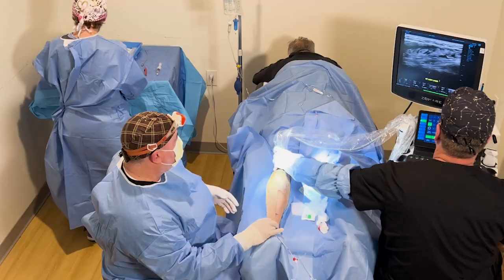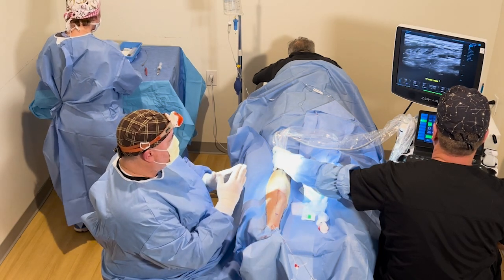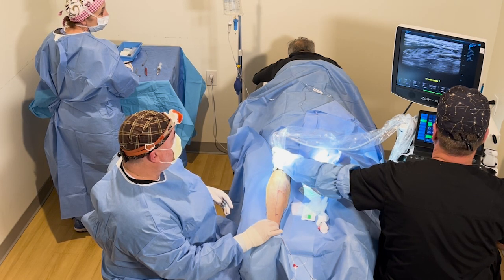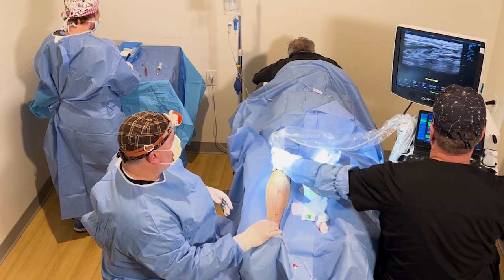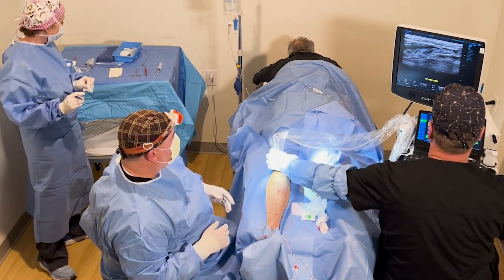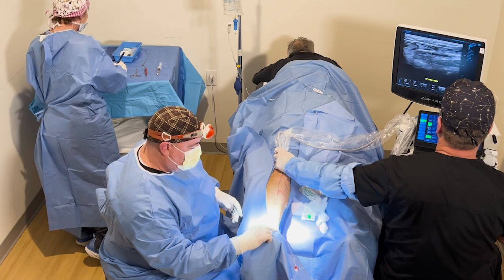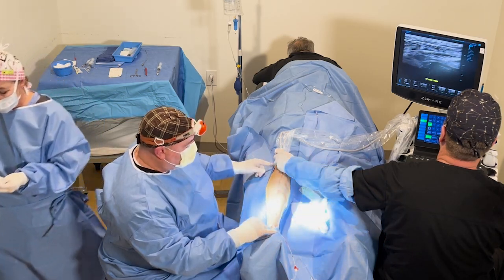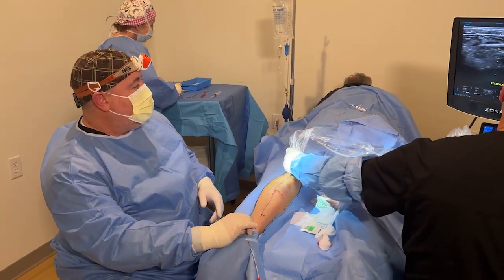I'm going to pull back. Scott's going to take a picture and take a measurement of how far we are from the actual place where the two systems meet. We're about 2.9 centimeters from the junction, approximately — and that's good. Anything over two is acceptable. Now Tammy's going to make it hot. Our length is 42, and there are little demarcations indicating how far we are from the tip, which gives us our measurement of how long the procedure in length is.